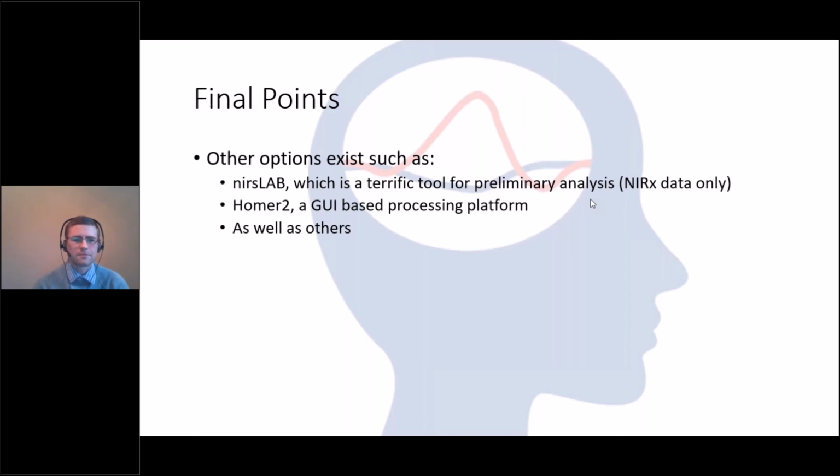All right. So next question is from Adam. For AR filters, is there a difference between NIRS.modules.AR_IRLS versus AR_prewhiten? So I believe, well, there is a difference. They're two different things, but I believe the AR_IRLS actually houses a pre-whitening filter within it. The AR pre-whiten filter is just the pre-filter.